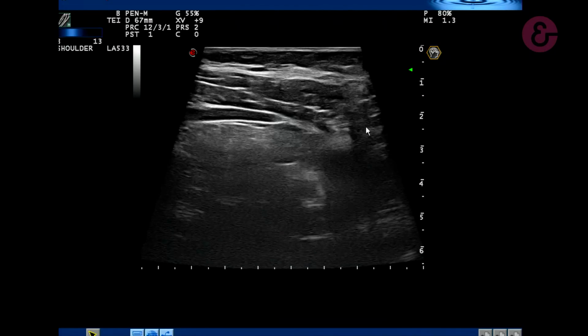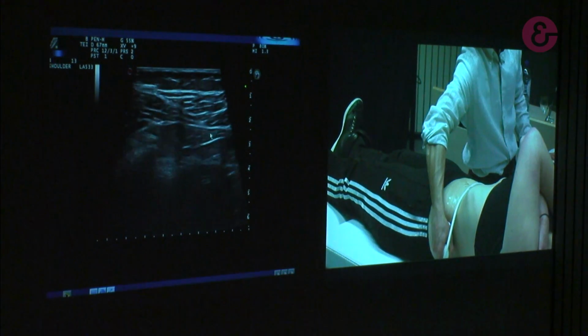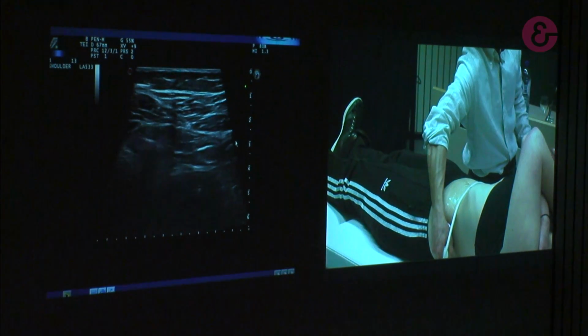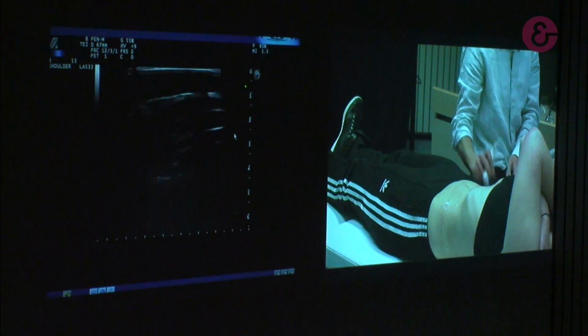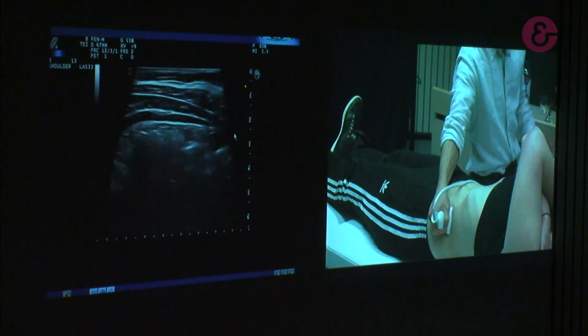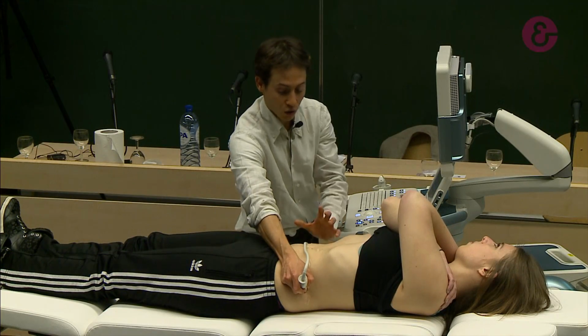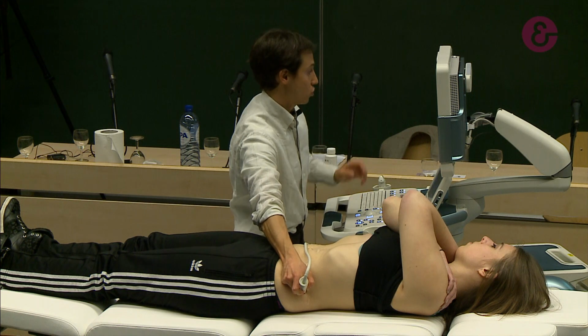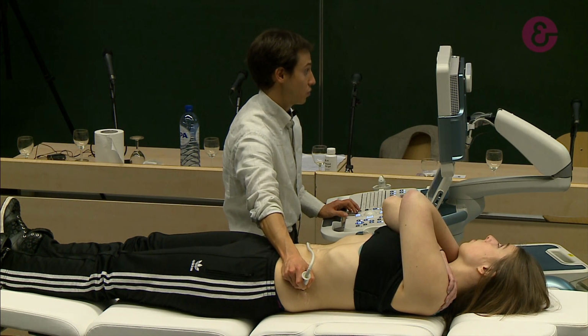And from the other direction, this line will arrive to, I don't know if I'm able to show, but to the tip of a vertebra. So it's the same anatomy on the other side. So if she's able to contract this muscle, it is like a corset for our back, and so gives stability of the lumbar area.